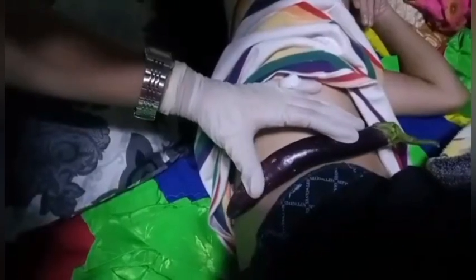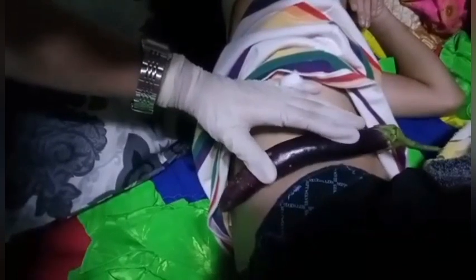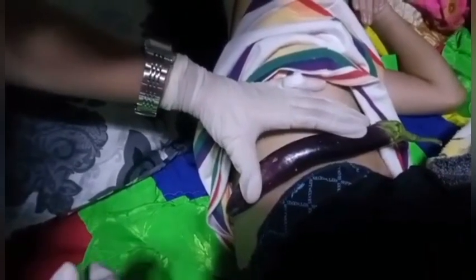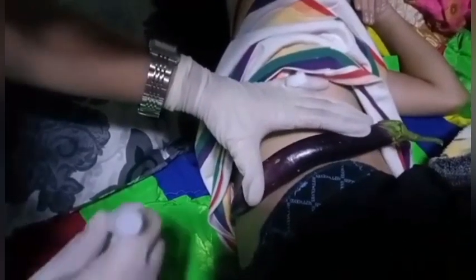Hold the gauze pad between the third and fourth finger of the non-dominant hand, and then uncap the syringe and hold the syringe between the thumb and the forefinger of the dominant hand as if holding a dart. Place the ulnar side of your non-dominant hand just below the injection site and hold the patient's skin laterally about 1 to 1.5 inches. Hold the position until you have inserted the needle.